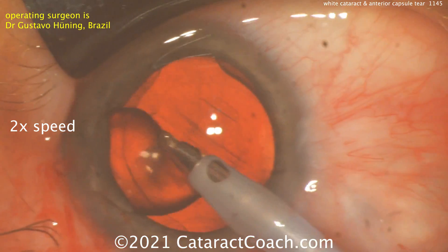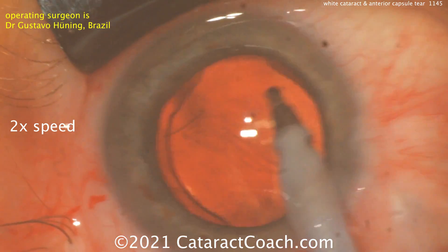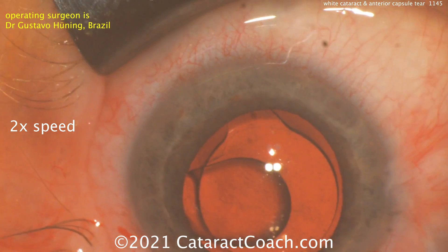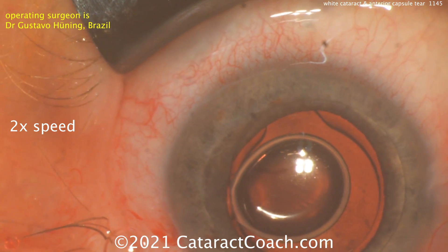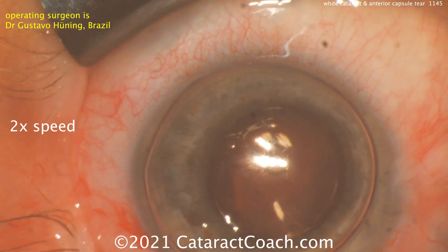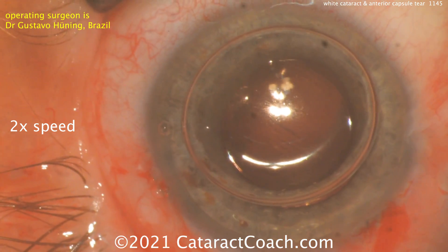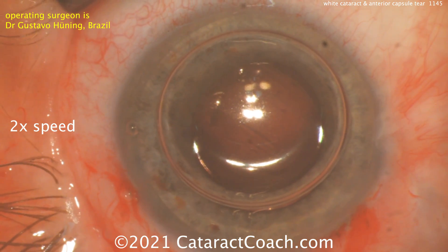Dr. Heuning is a fantastic surgeon. What's coming out now — was that viscoelastic? No, that's silicone oil. This is an eye that's already had retina surgery, vitrectomy, and silicone oil placed. A little bit of oil is coming through that one area. When the AC collapses, more silicone oil comes through that area of capsular run-out, and now there's a lot more oil in the anterior chamber. You need to pressurize the AC to prevent that. A big air bubble like this can also help. Dr. Heuning is also a retina surgeon, so he's very comfortable working with silicone oil. You definitely want to avoid prolapsing more silicone oil into the anterior segment.